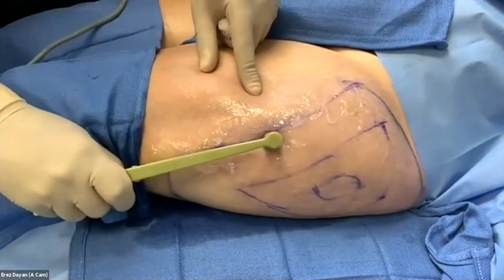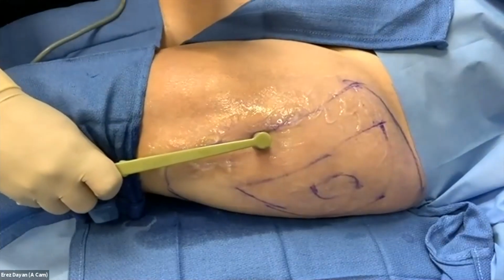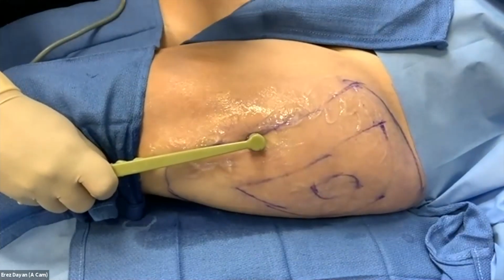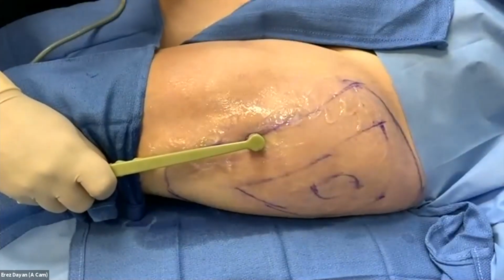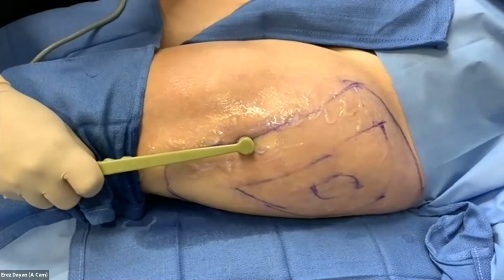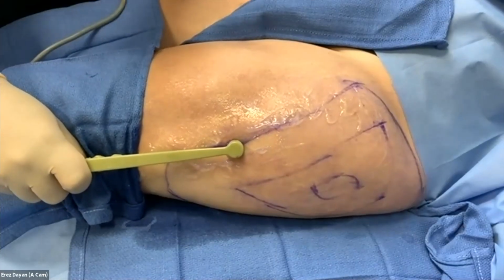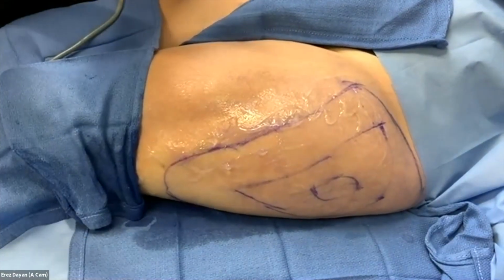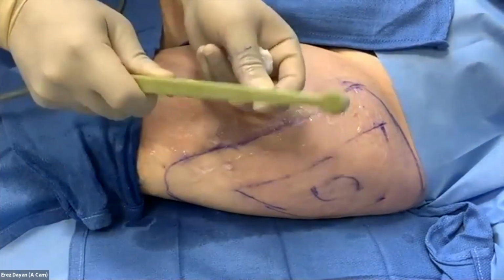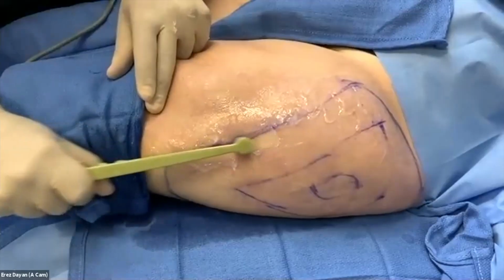So I'm just going to go back to that row. Now, if we had a FLIR camera set up, you would see a white kind of strip indicating that it's heating up. Good, so that noise indicates that the device was uncoupled for a second, which can happen when the internal and external probe are not aligned like that. So that noise doesn't really bother me. It just means that the device didn't fire.